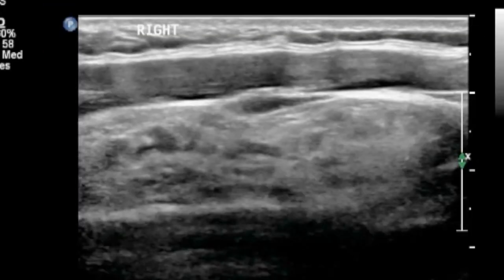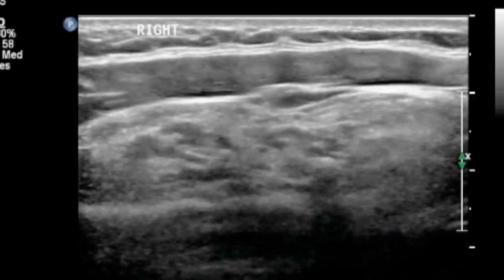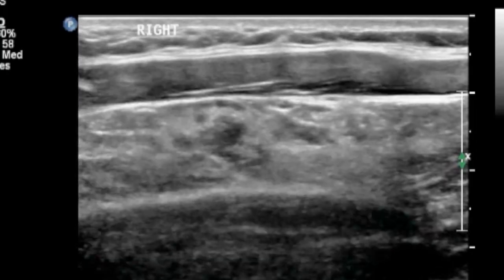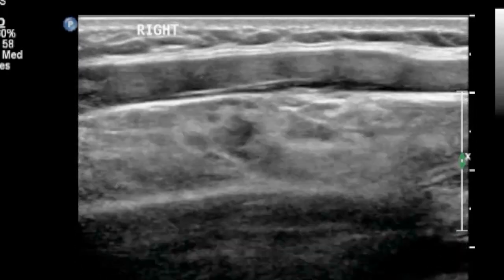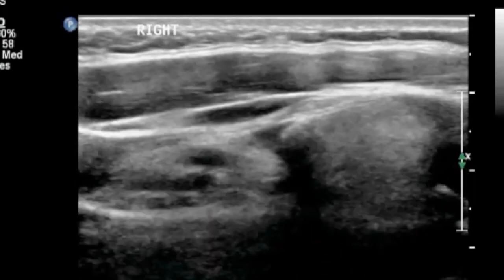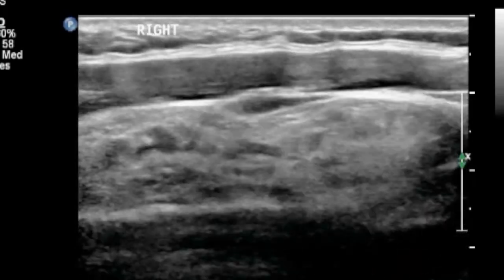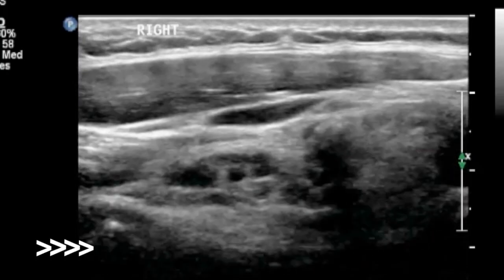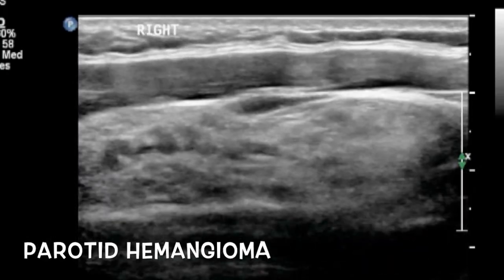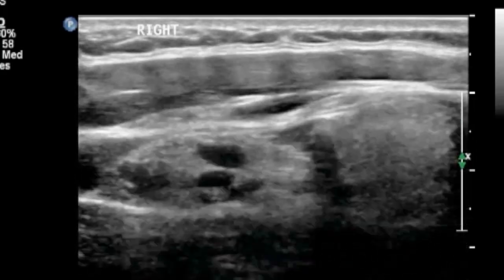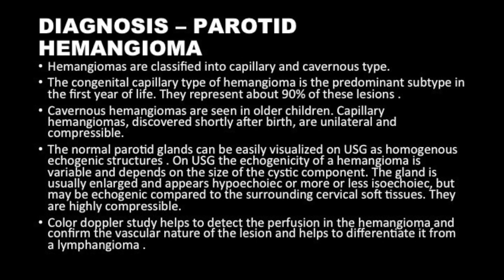In this video, you can see that there are multiple hyperechoic foci with shadowing seen within the gland, and the architecture is distorted. These are classically nothing but phleboliths, and whenever you see phleboliths within a lesion, always think in terms of hemangiomas.